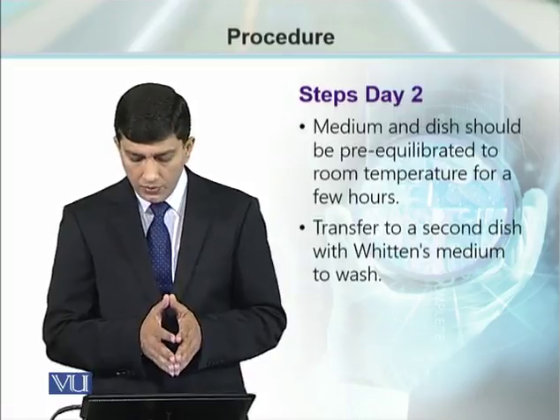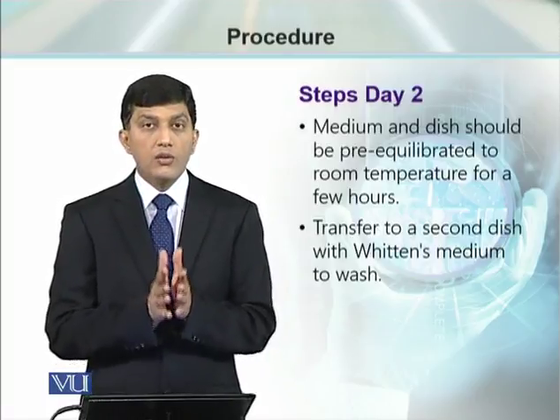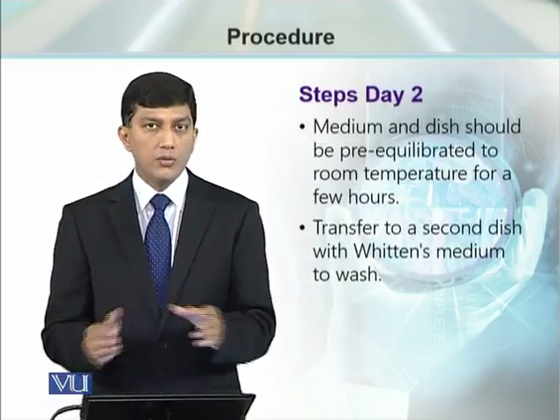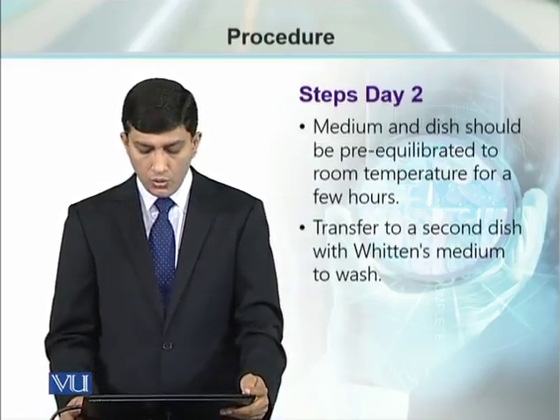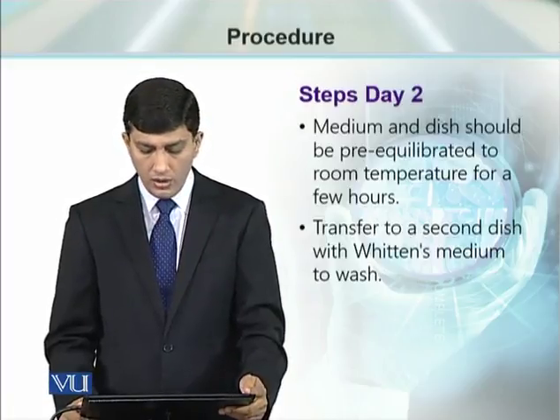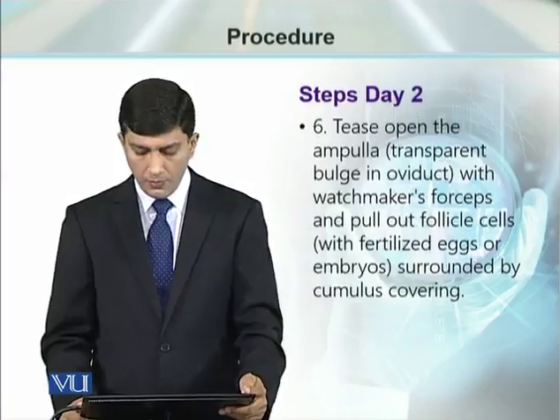We transfer the oviducts removed from those females to Whitten's medium in a second dish, after washing with Whitten's medium.